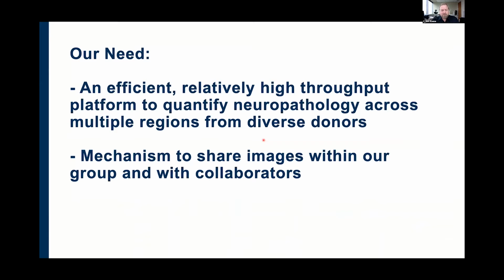And so we recognized two real needs. One was this sort of efficient, relatively high throughput platform or approach to build quantitative neuropathology workflow and data. And then, of course, a mechanism to share images within our group and with our collaborators.